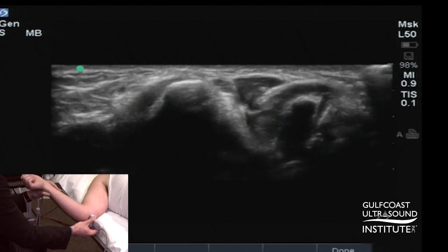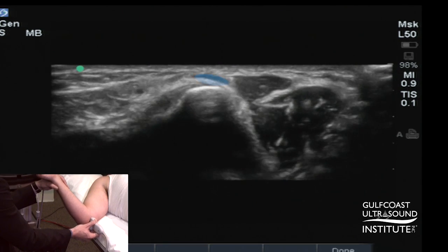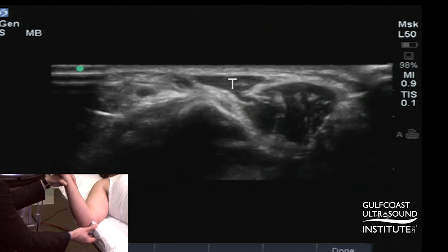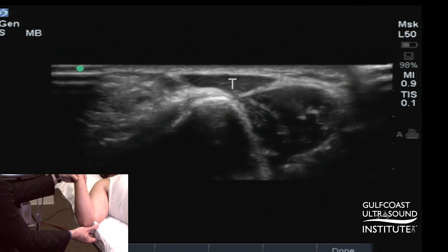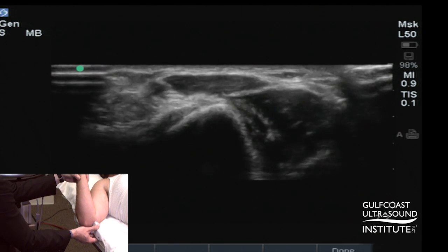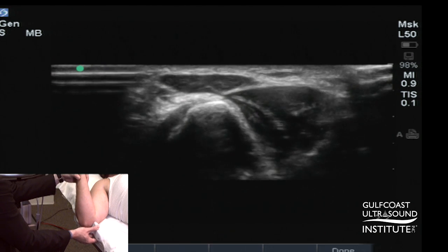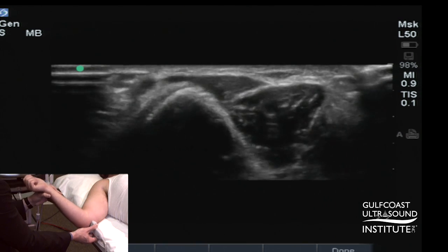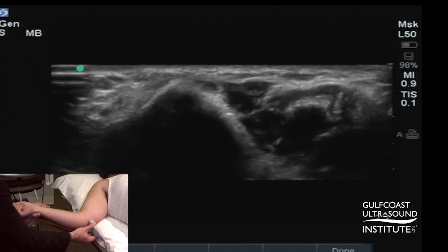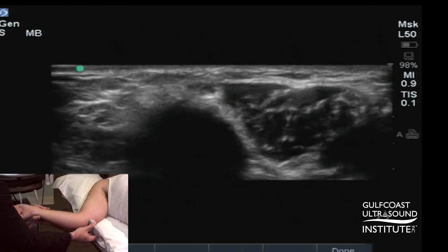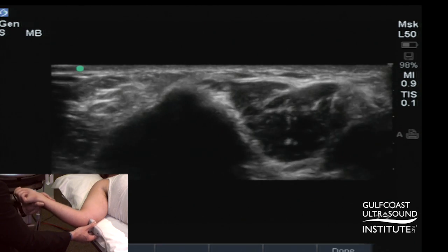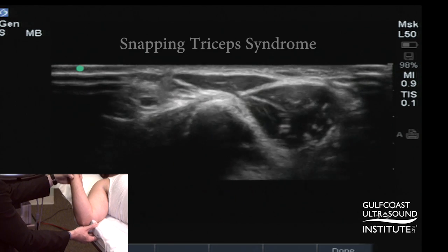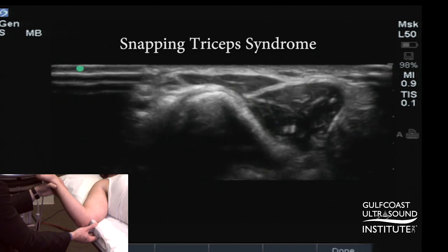Incidentally, with this patient, as I flex, note the ulnar nerve dislocating over the apex, followed by the medial head of the triceps moving anterior to the medial epicondyle as well. This is an abnormal condition — normally the triceps and the ulnar nerve should be located behind the medial epicondyle. Often you can feel two snaps, and this ulnar dislocation in combination with the medial head of the triceps is termed snapping triceps syndrome.